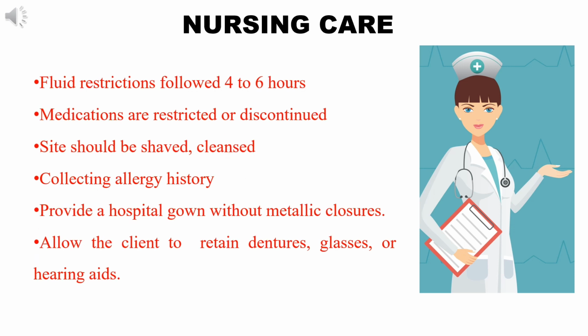The site should be shaved and cleansed. Here, anesthetize with local anesthetic agent where the catheter is inserted, and explain the sensations experienced as the catheter is advanced. After that, collect the allergy history.